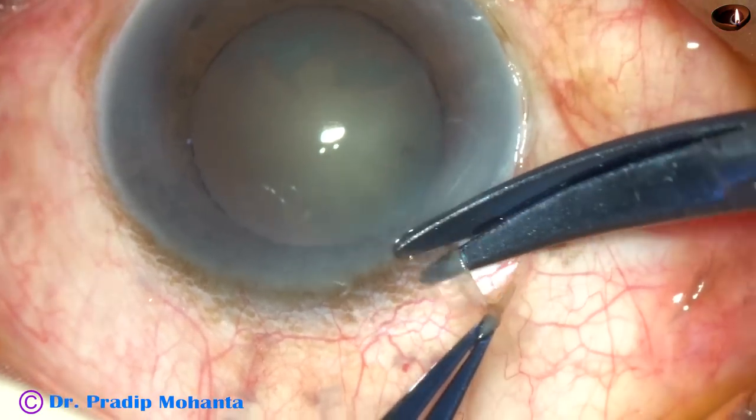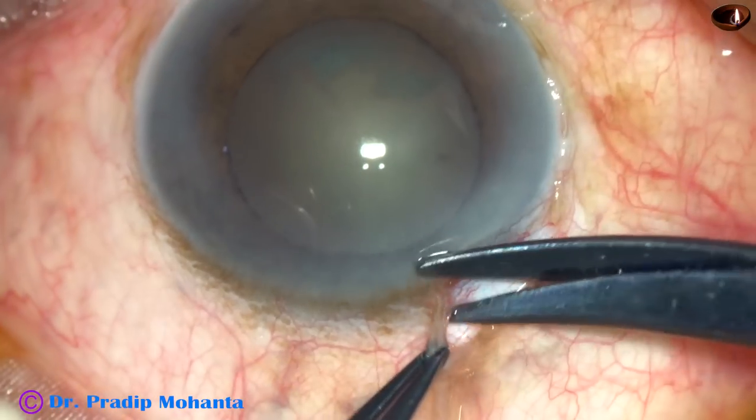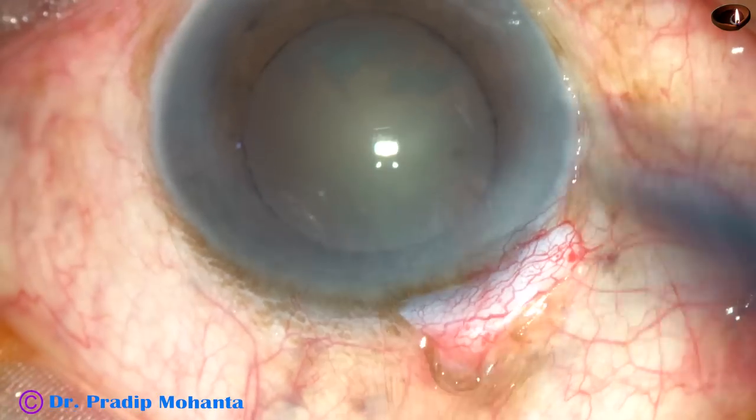Now, peritomy. Peritomy is being done from 10 o'clock to 2 o'clock, about 4 clock hours. Do the peritomy just along the limbus.